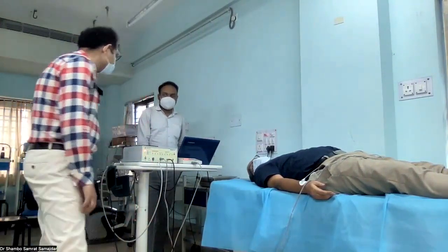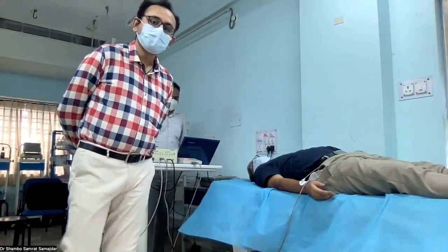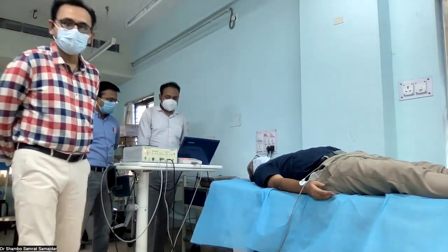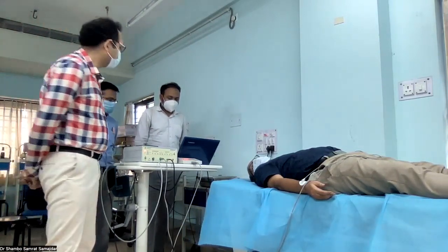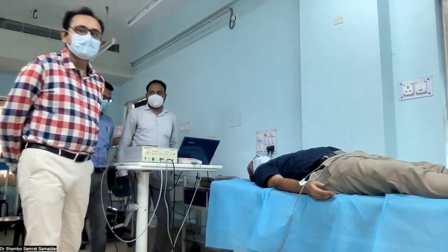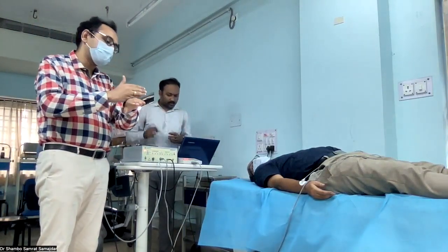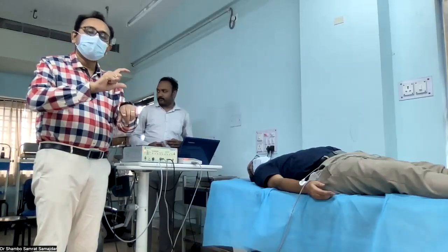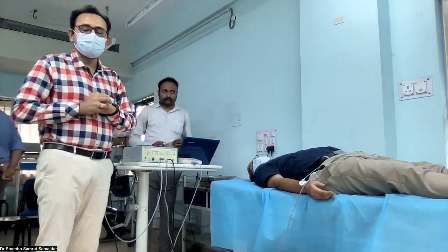Remember, after taking the ECG for 1 minute, we will record it and save the result. This is important because when we analyze the report, we will find the VLF, HF and LF values we already discussed. The RR interval changes are translated into the language of waves, that is the very low frequency wave, and HF, that is the high frequency wave.